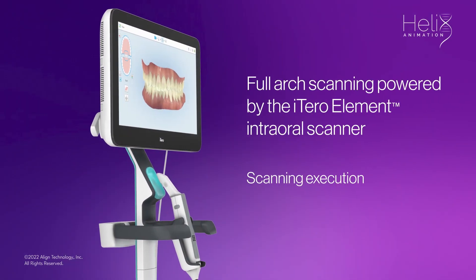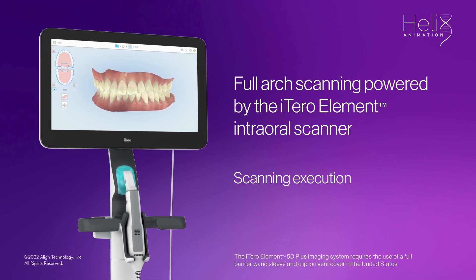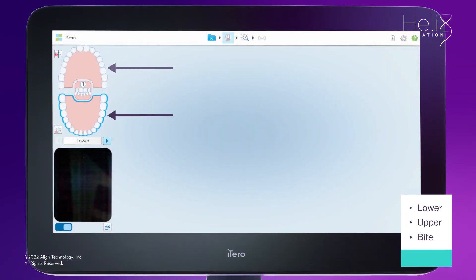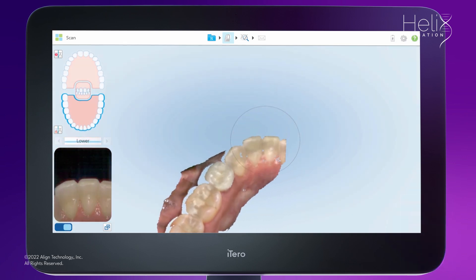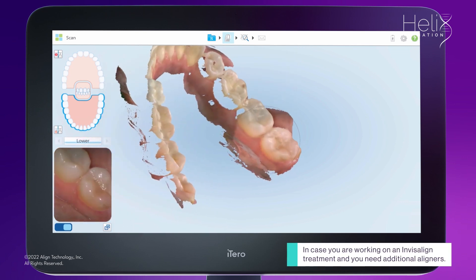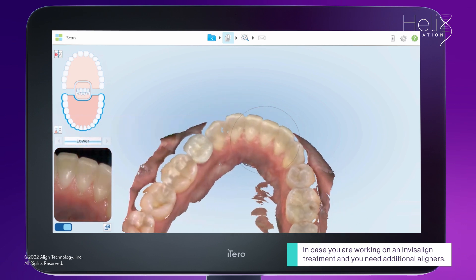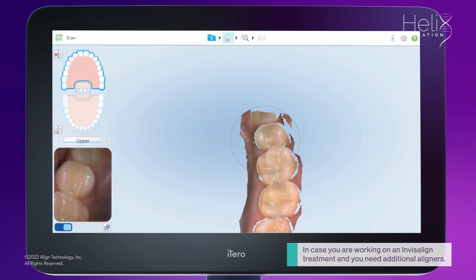Welcome to Full Arch Scanning, powered by the iTero Element Intraoral Scanner. To complete the scan, you should scan the lower and upper arch and the bite. You can also invert the order starting from the upper arch. Please note that even in cases where you need additional aligners in one arch, we highly recommend scanning both arches to provide as much information as possible for fabrication of the new aligners.